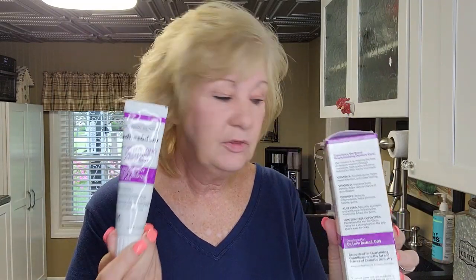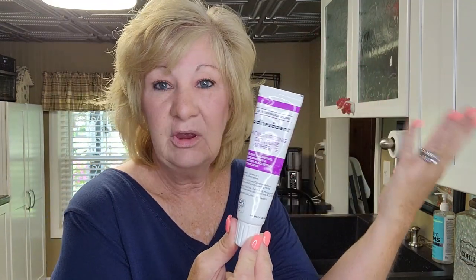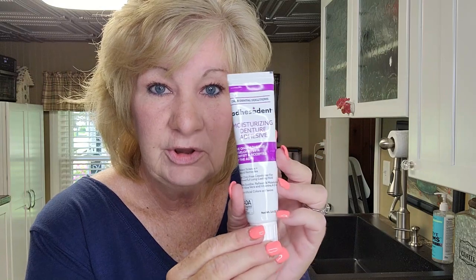Going through the ingredient list, this has a lot of good ingredients in it. The problem is it's hit or miss — it's going to work for you or it's not. I've spent the last week working with this, seeing how I can get it to work for me. With a lot of denture adhesives out there you have to do that. This applies to your denture differently than, say, a Fixodent or Secure.